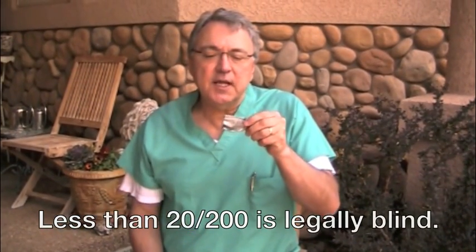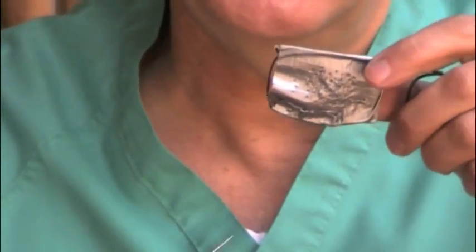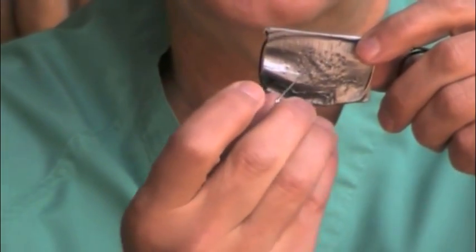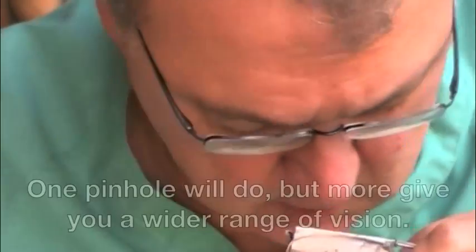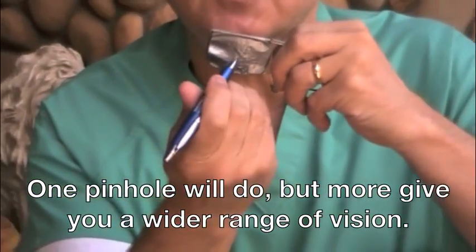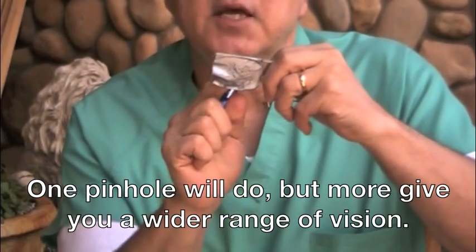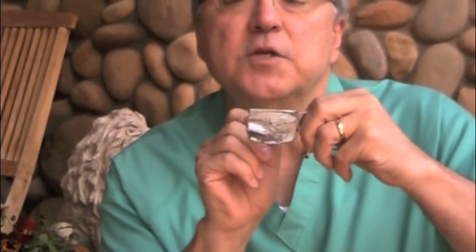All you need is something like some duct tape — tape it sticky sides together over a frame or make your own frame, then stick little pinholes in it all around like I've done with this. If you want a little bigger hole you can use something like an ink pen-size hole, just stick it in and make sure the light goes all the way through.